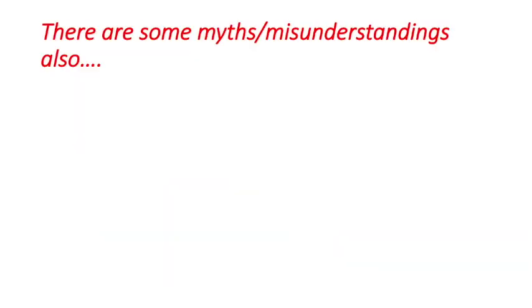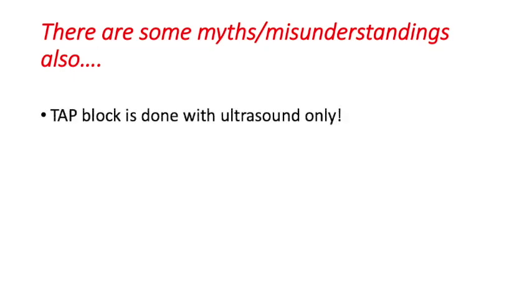There are many myths and misunderstandings about tap blocks, like tap block is done with ultrasound only. This is the biggest myth. Many people believe that it is done with ultrasound only, but you can do it with landmark guided technique. You can do it with PNS guided technique that is described by Dr. Surjit Giri. You can do it with ultrasound also. There are various approaches with which you can give tap block with equal efficiency.